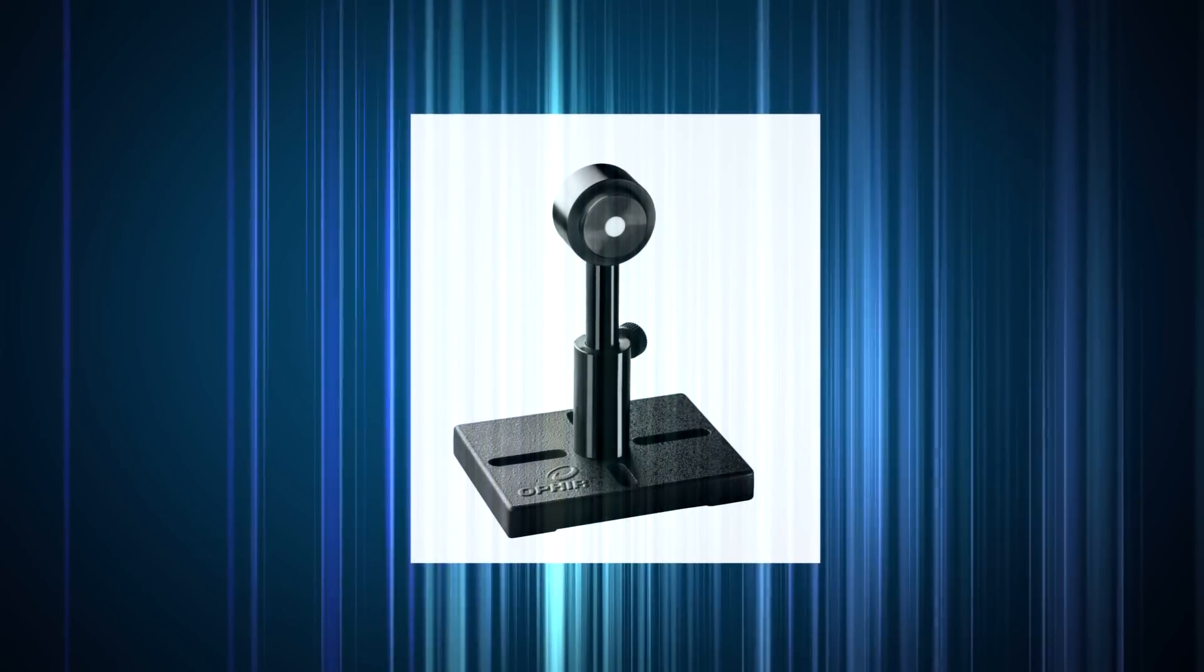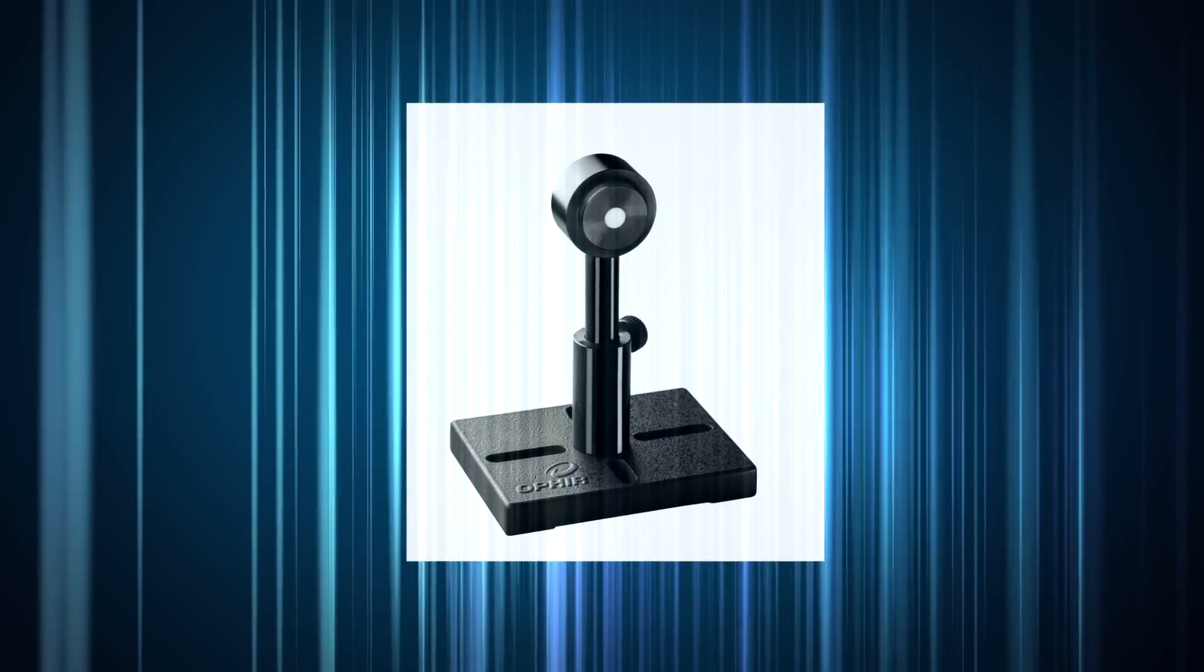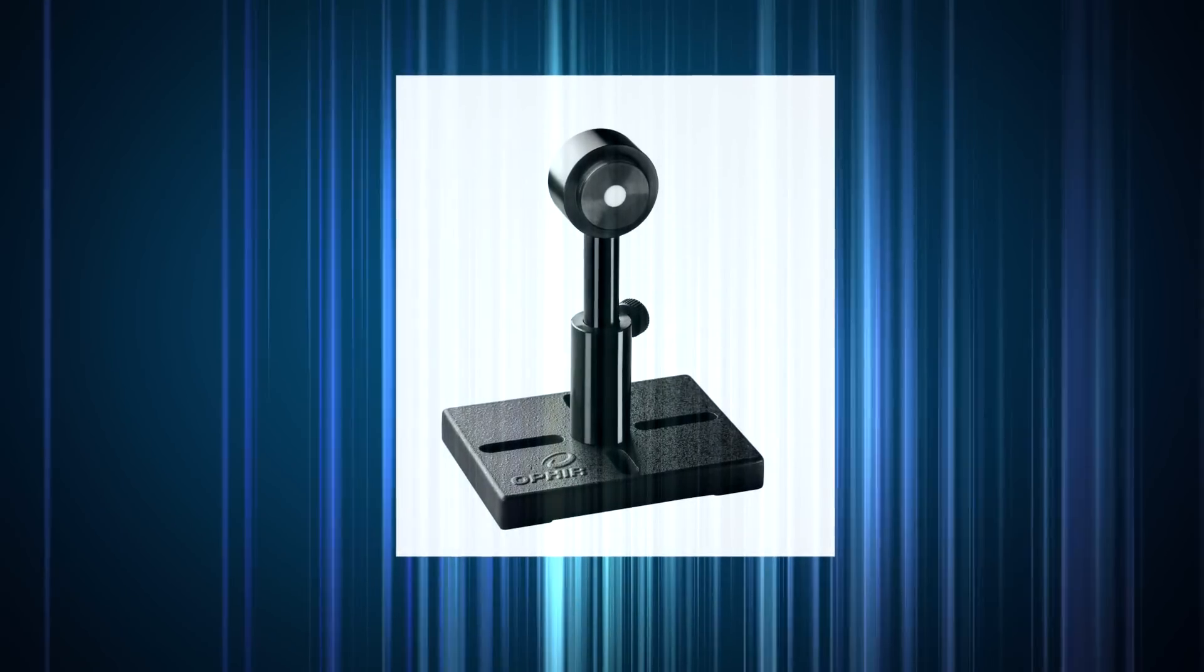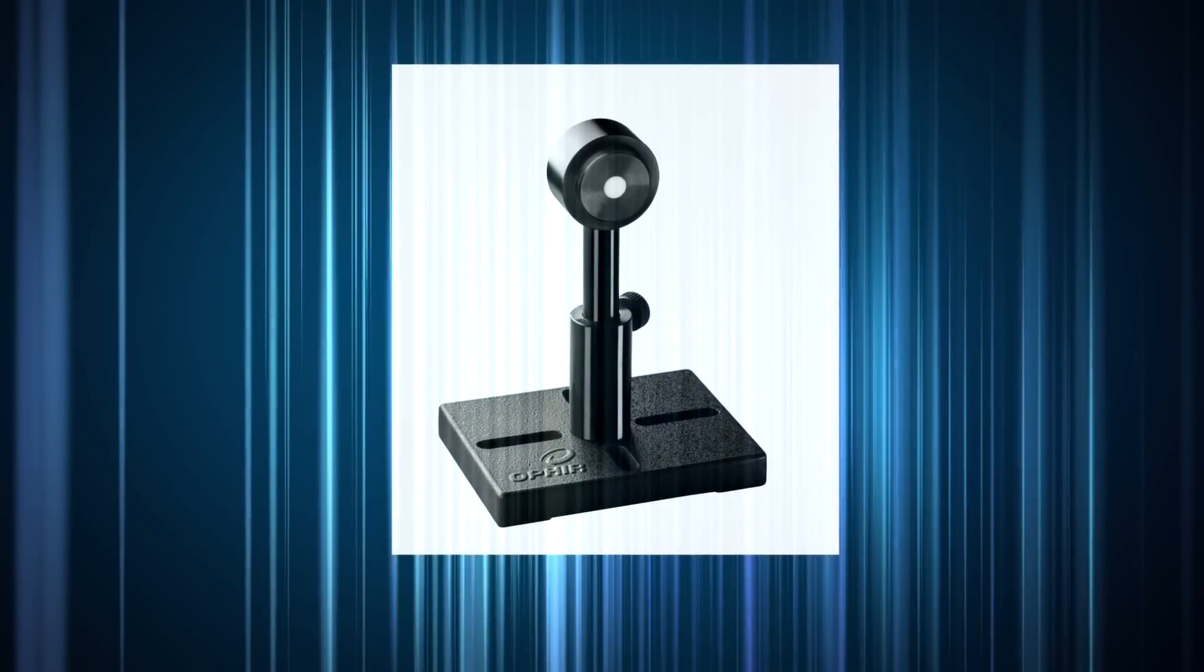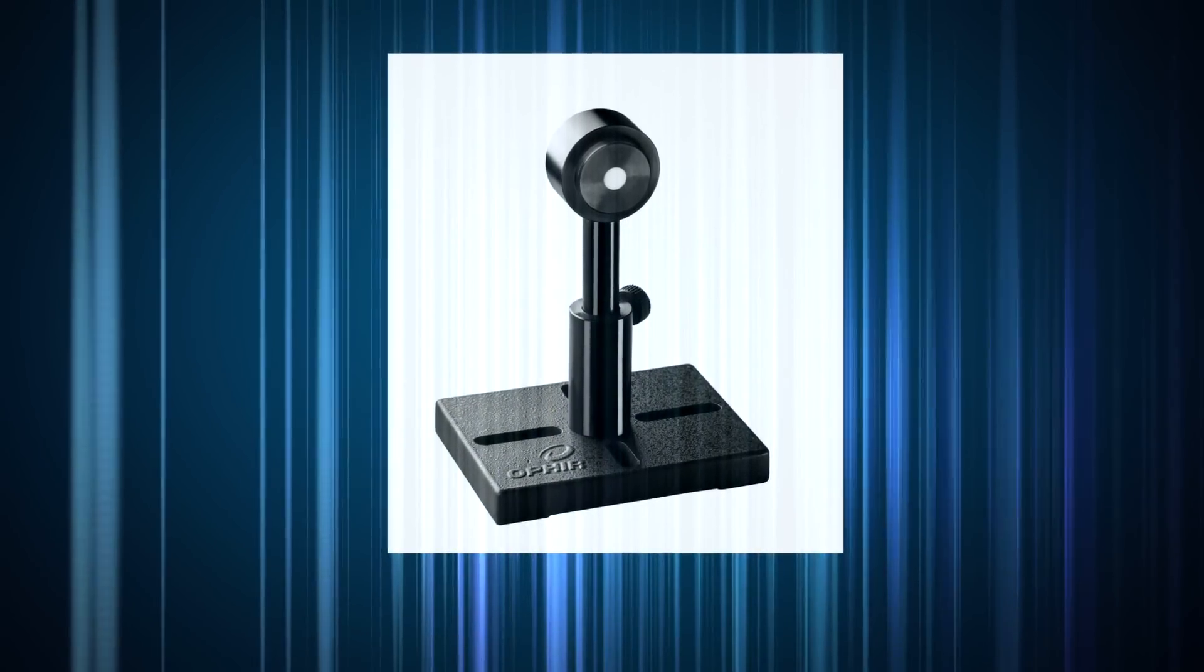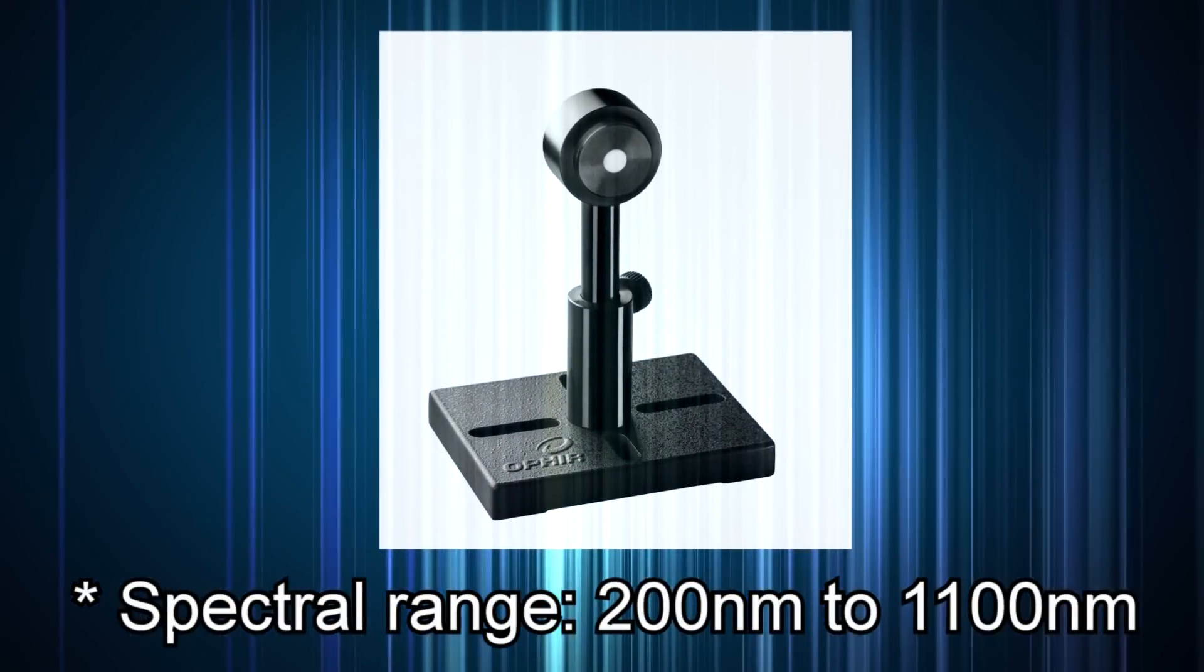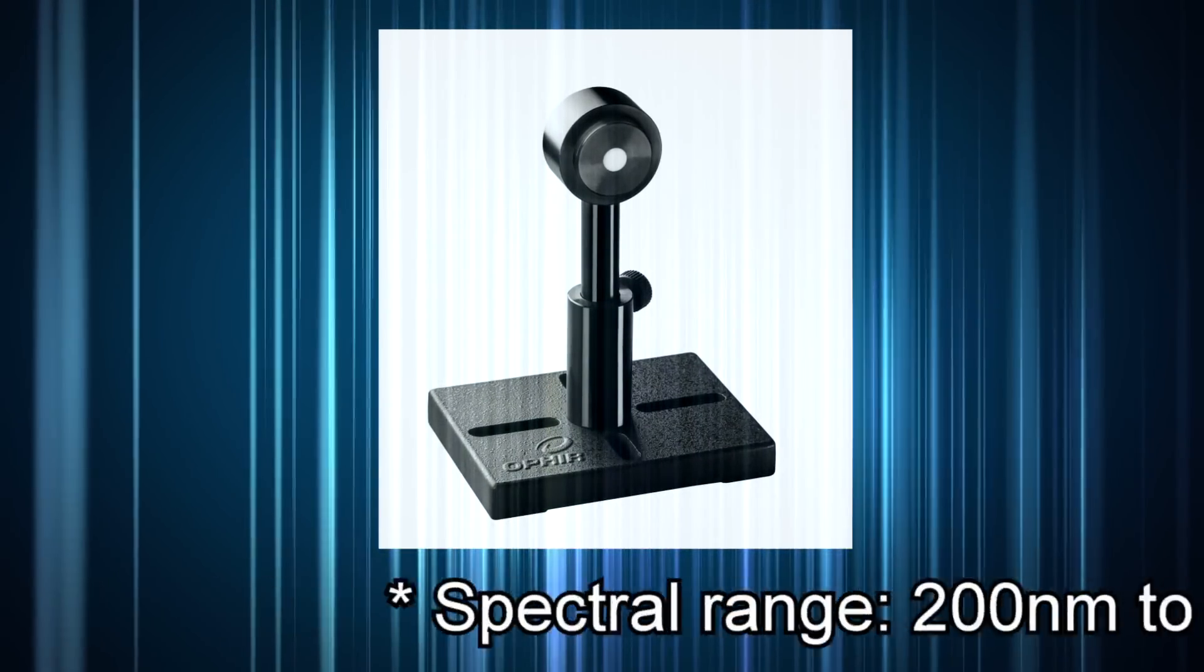The Ophir PD300RM is a highly accurate, low-cost instrument designed for meeting these needs. It's based on a photodiode sensor using a UV-enhanced silicon photodetector, so it covers a wide spectral range from 200 nanometers to 1100 nanometers. It's calibrated over this entire spectral range, not just one wavelength.